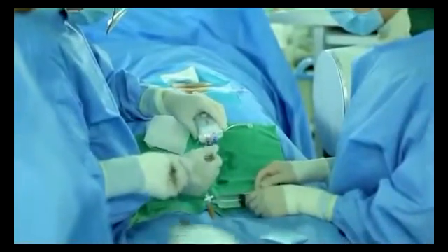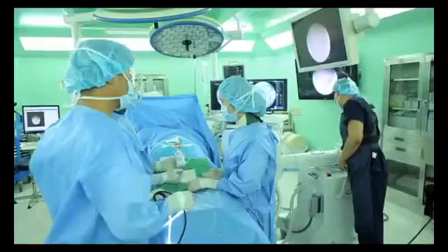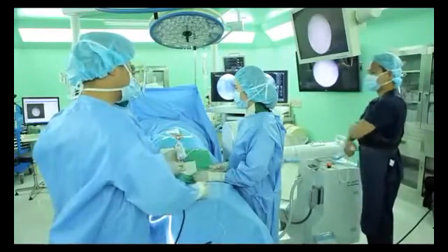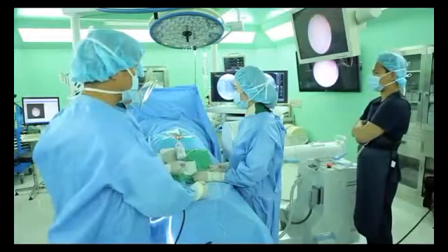Now, it's time to insert the endoscopic cable through the catheter to secure the view. There are some cases where you can't see clearly through the endoscopic cable at the beginning of the procedure. In this situation, how can you solve this problem?